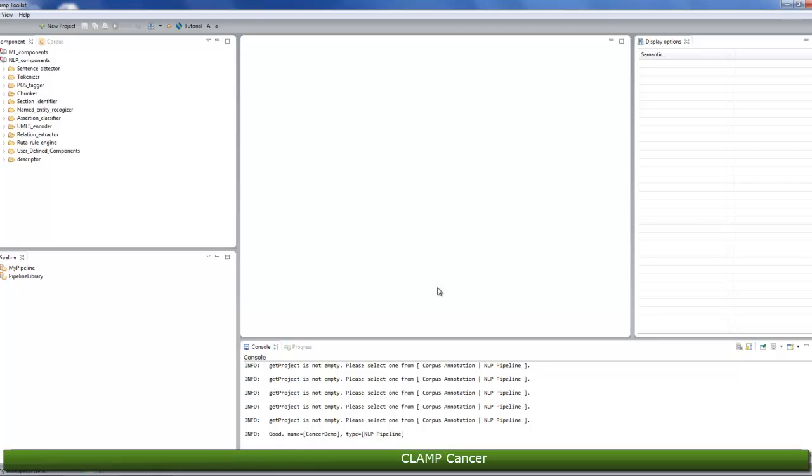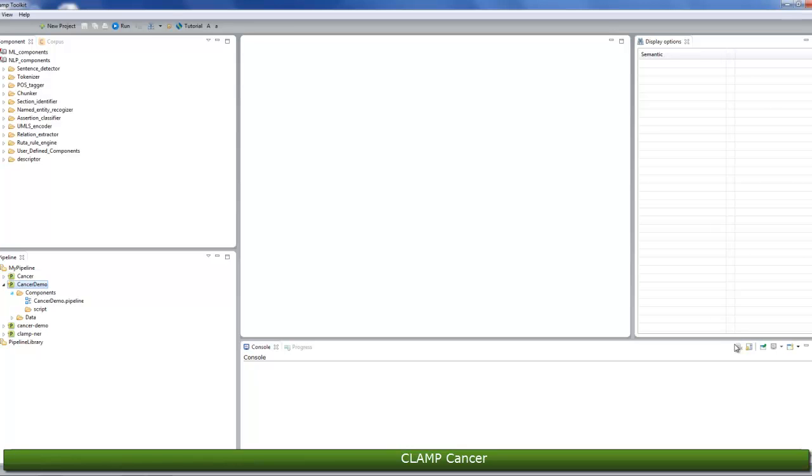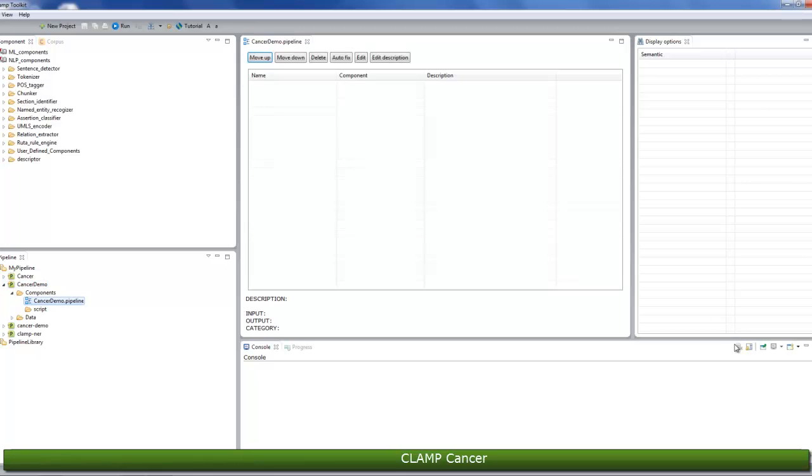Now it's time to configure your pipeline. To do so, go to the pipeline panel, go to the folder you just created, open the components folder within it, and double-click on the cancer demo.pipeline file. This will open up the file in the middle window.